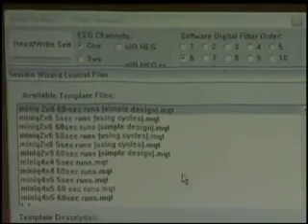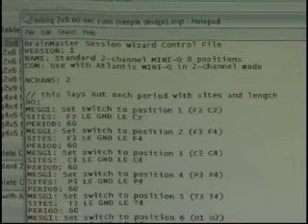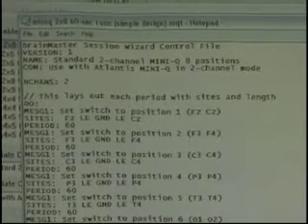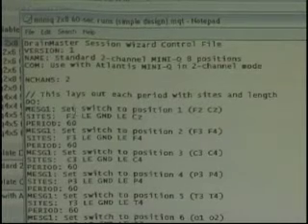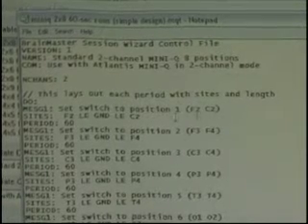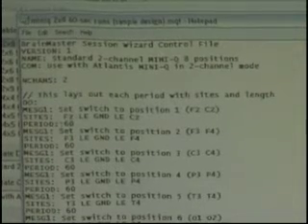Available template files — these are different examples of Mini-Q files that were built. If you highlight one and go to View Template, you can go in there. It's a very simplistic programming language, but someone willing to do this can write their own prompts. For instance, message one: set switch position one, FZ/CZ sites, 60 seconds, and then the next message comes up.